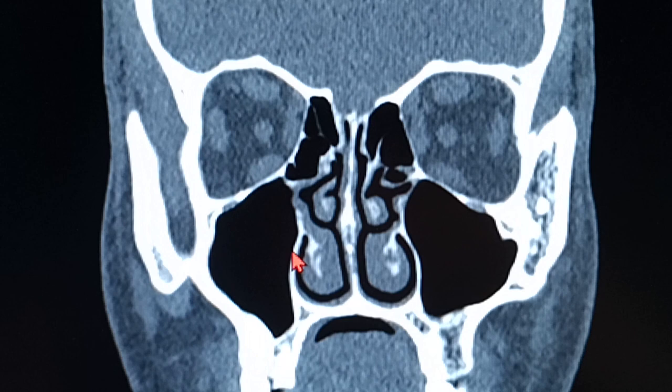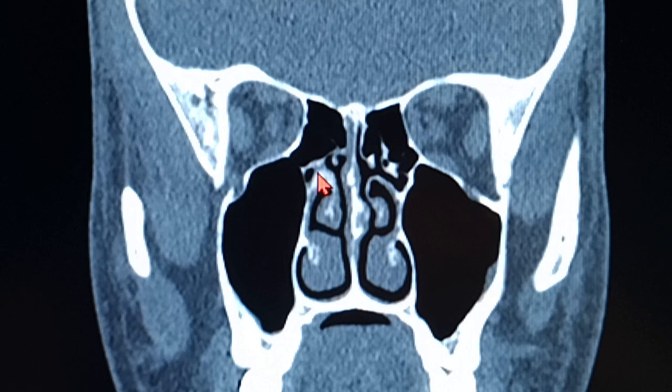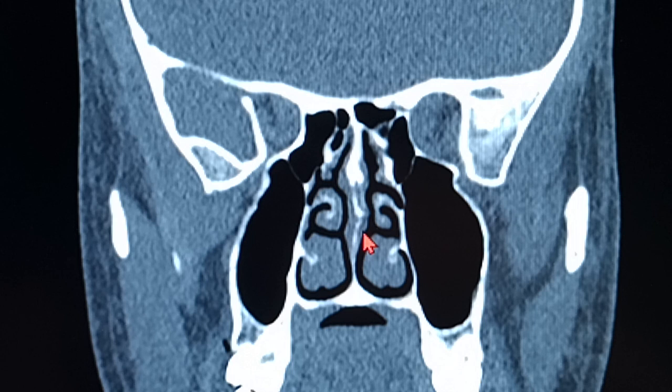So, keep on going, I'm going behind. We've done the arteries, the basic anatomy, the sinus over here, the orbit, that's the infraorbital nerve. I've done a lot of videos where I've shown the orbital decompression, so that is also taken care of. The skull base, the septum, the turbinates, the anatomy of the osteomeatal complex, the orbit. When I do an MRI scan, I'm going to show you all the structures, the soft tissues, much more clearly, which will be helpful for you in skull base surgeries, and not in normal FESS, but in skull base surgeries. MRI is useful in cases of inverted papilloma, tumors in the sinonasal cavity, vascular tumors like capillary hemangioma and big tumors like that. But for normal cases, the CT scan is enough for you.